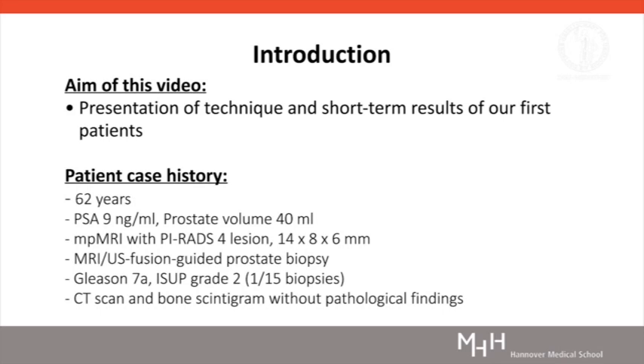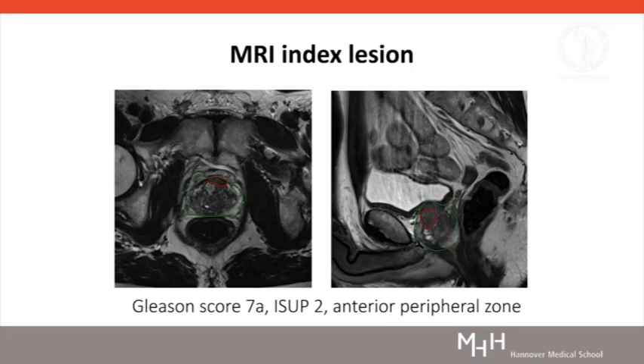In this video, ultrafocal cryoablation is performed in a 62-year-old man diagnosed with localised prostate cancer in the anterior zone. Prior MRI Fusion Guided Prostate Biopsy revealed a Gleason score of 7A prostate cancer with ISUP grade 2 as the index tumour in the corresponding PIRADS 4 MRI lesion. Additional systematic 12-fold biopsy detected no further cancer foci. Prostate volume was 40 millilitres, initial PSA value was 9 nanograms per millilitre, and the MRI lesion size was 14 by 8 by 6 millimetres.